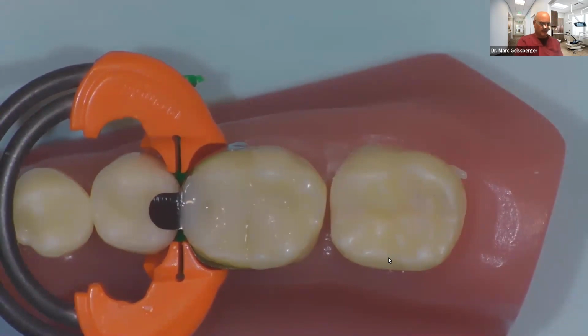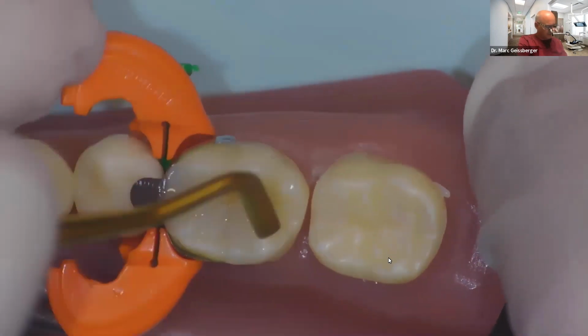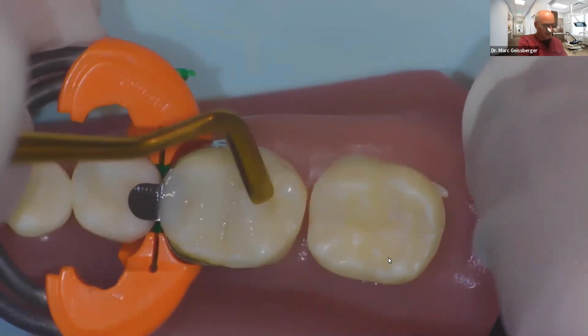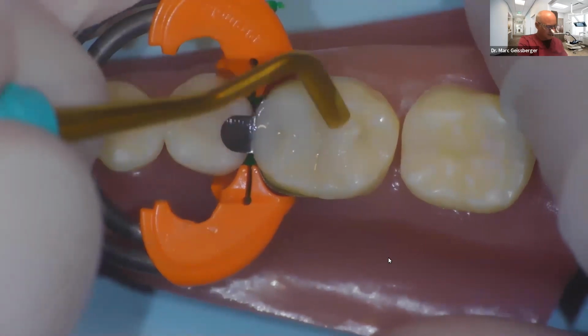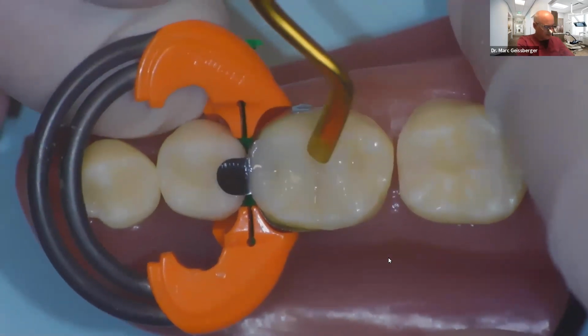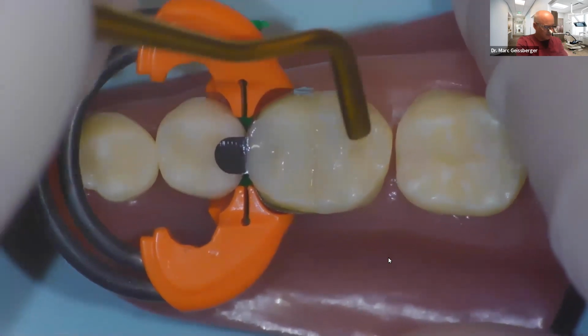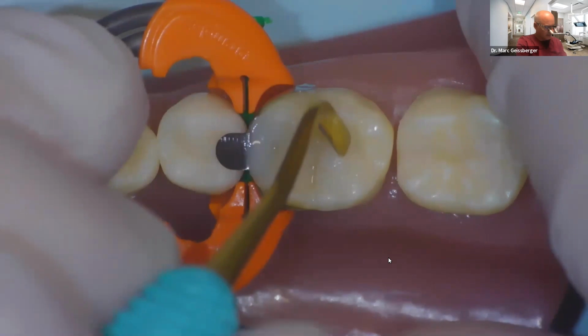And now I'm going to come back and do the distal buccal. I'm going to cut off a small amount of composite for that. Place this into place. And I have even room for my distal cusp. I'm getting fancy here on this one, you guys. I'm sorry, but it's what it is. So remember, my goal is to make a tooth look like a human tooth, not a blob of composite.